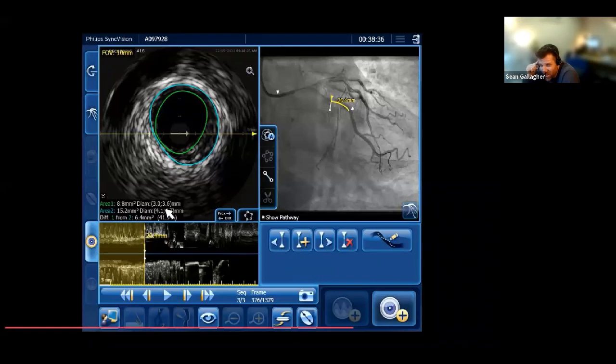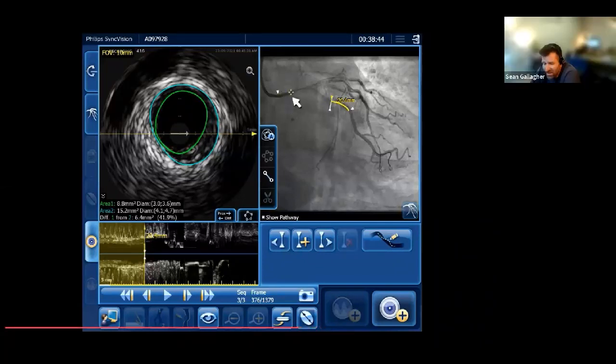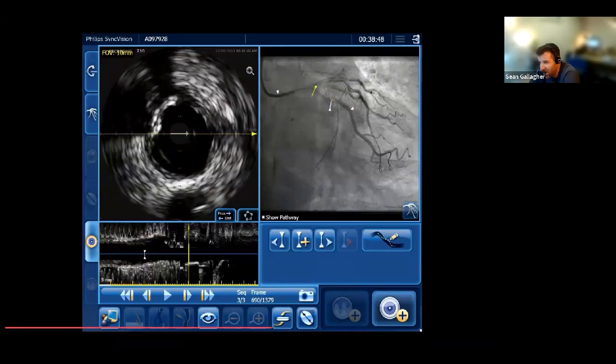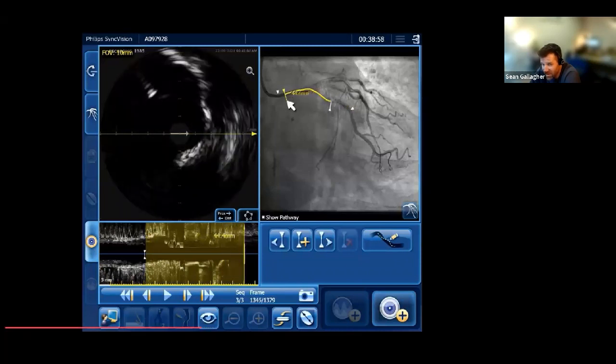I think that stent is going to take what it's going to take. I think that was one of the points I made before. We don't know what that platform is, and we don't know what it will do. Also, it depends which strut you've gone through, where the connectors are in relation to that, how that particular strut is going to dilate. To be quite honest, yes, there's a little bit of a dink in the balloon as it's gone around, but generally, I think that's pretty good expansion at the ostium of the circumflex.